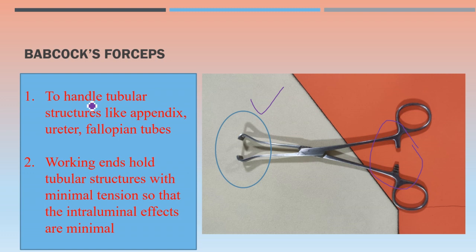Babcock's forceps — focus on the distal end and the lock. It is used to handle tubular structures like the appendix, ureter, and fallopian tubes. The working ends hold tubular structures with minimal tension, so intraluminal effects are minimal and the intraluminal part is not damaged. That is why Babcock's forceps is preferred for tubular structures.